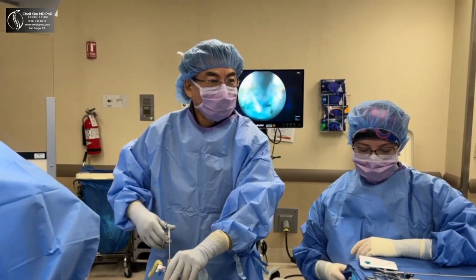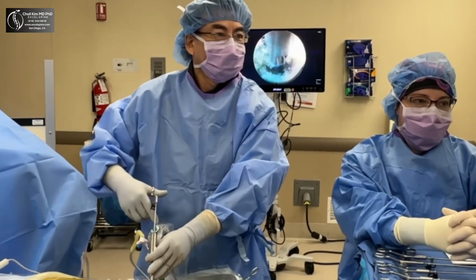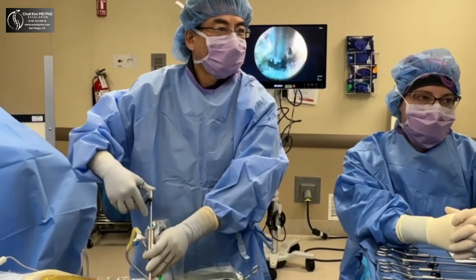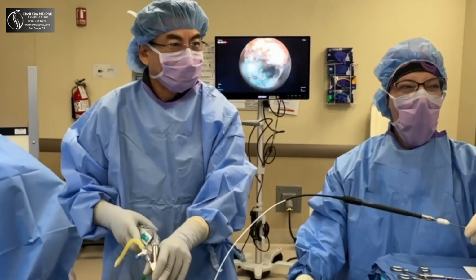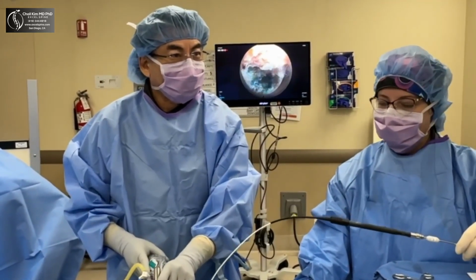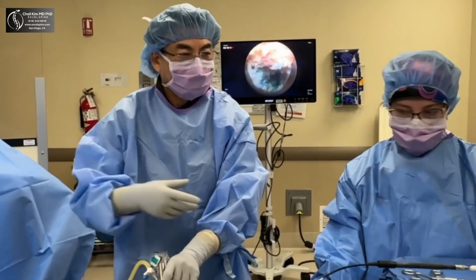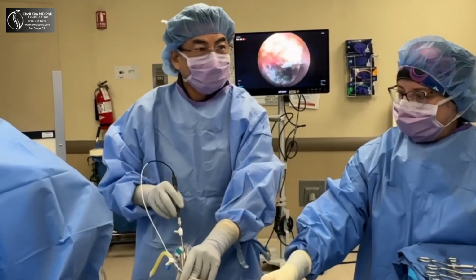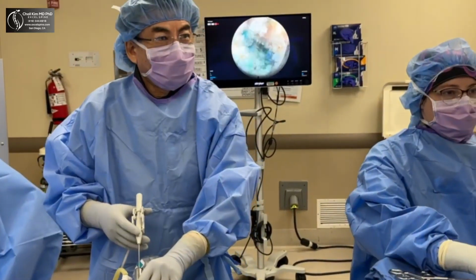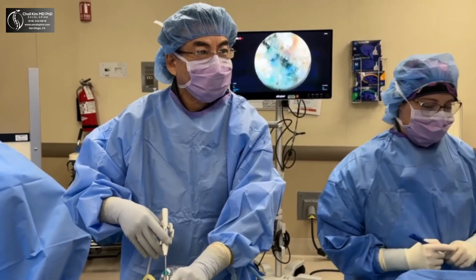Now remove all the loose pieces. There's a lot, it looks like. I'm almost at the midline now. Look at that thing bulging out. That fat is what surrounds all the nerves. Look, it's bulging out now and it's pulsating. I feel so good. Oh, I'm feeling good. So I got everything. That was the cavity where the disc protrusion was.